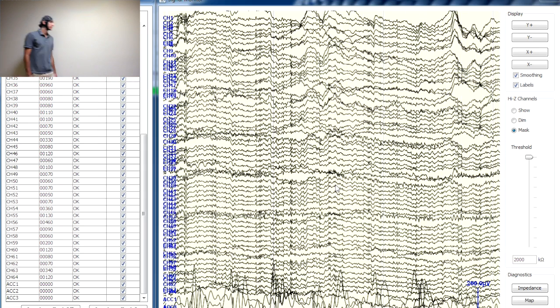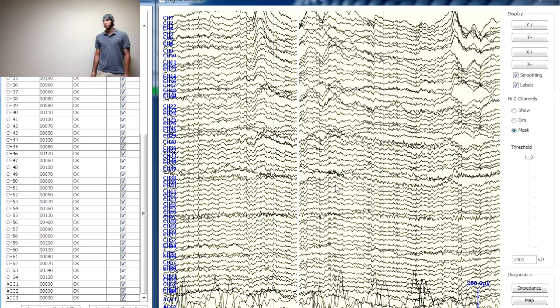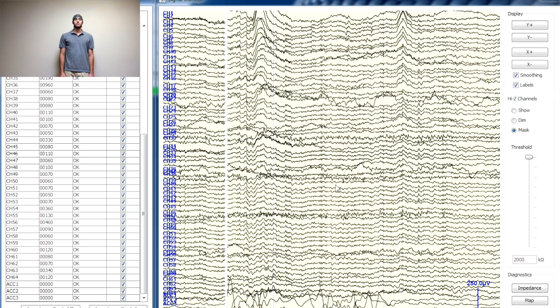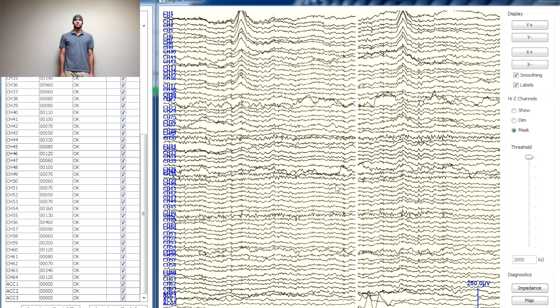Data files can be converted and imported into multiple analysis packages. For ERP or other experiments that require millisecond precise timing, you can use our trigger box to send markers to the EEG amplifier without the need for wires.